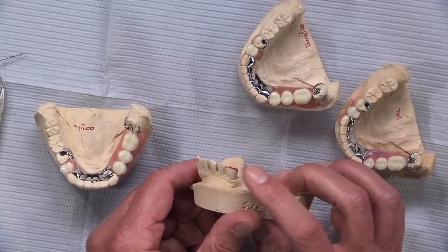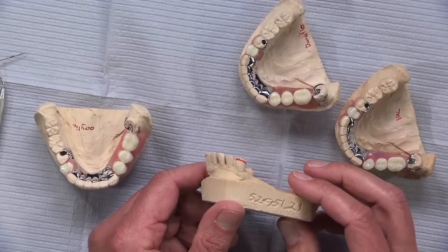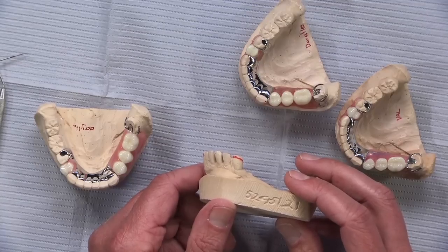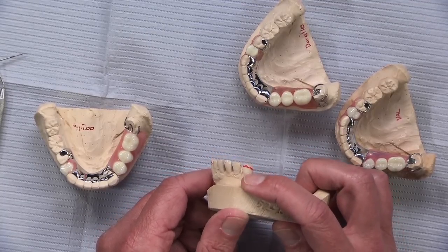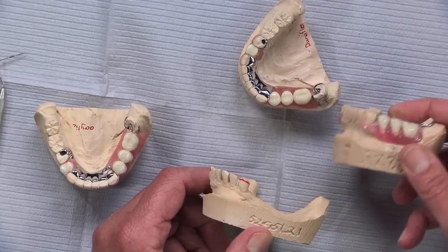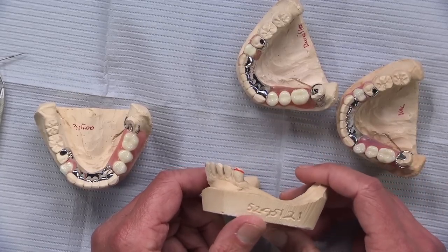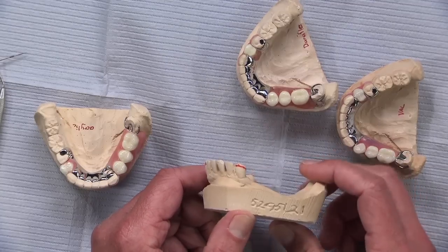So when we see something like this where the height of contour is marked that high up on the tooth, this is really a good example of where an eye bar would be more appropriate. This is one of the times where, with an eye bar, we're going to be able to get some good retention down here without having to cover the whole tooth. Because as aesthetic as these clasps might look on these two examples, if you take that and cover the tooth all the way up to here, that pink tooth is not going to be very aesthetic, and you're probably better off with an eye bar that's going to end right about there.